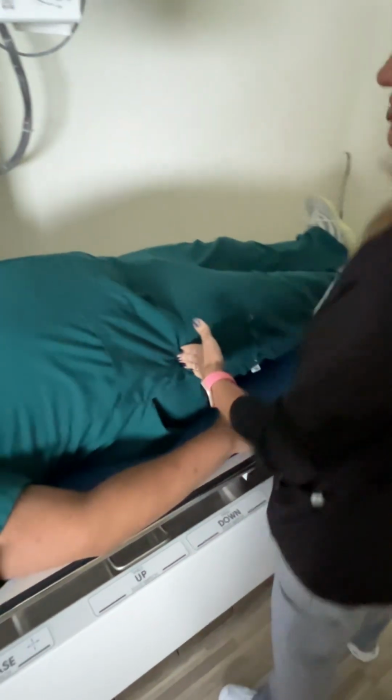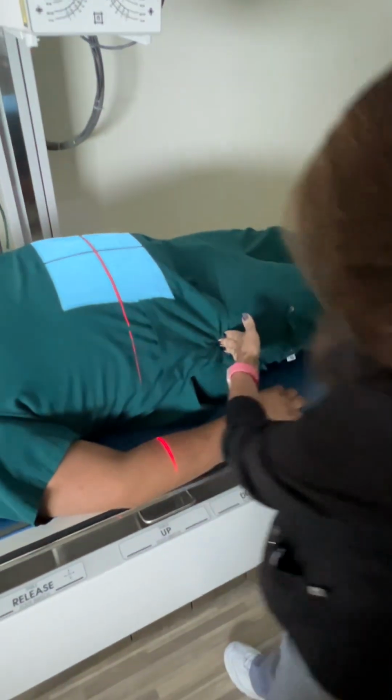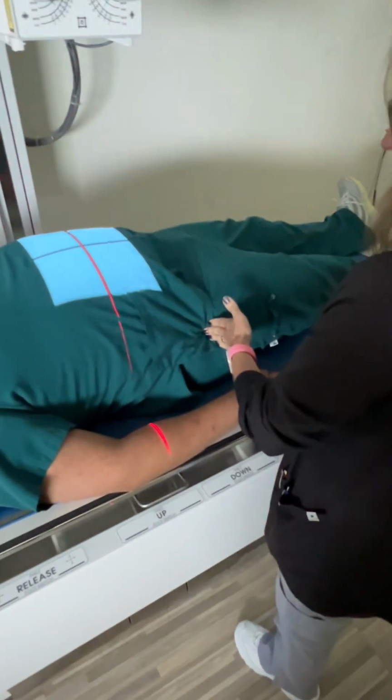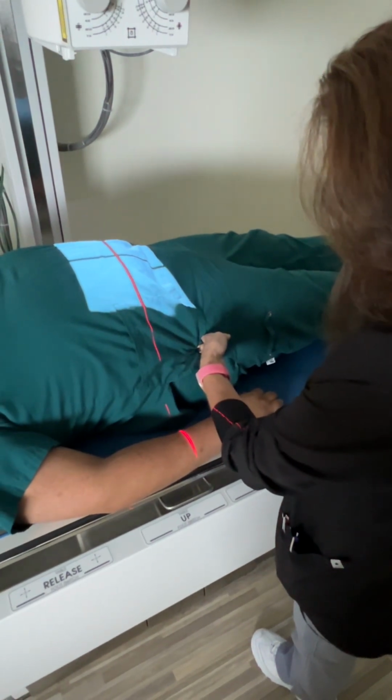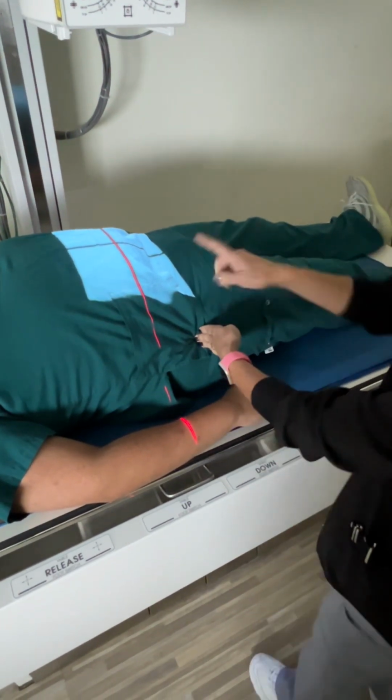There we go. So greater trochanter is right here. So I'm gonna move him so that my light is going to capture. Now it's deceptive.